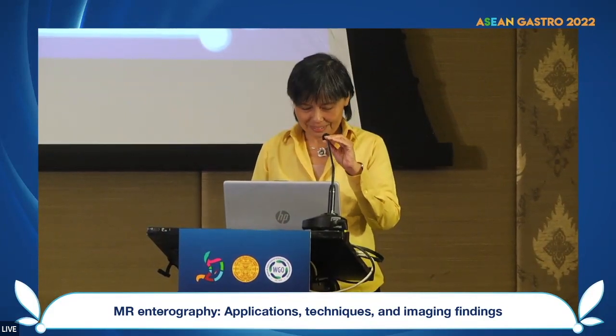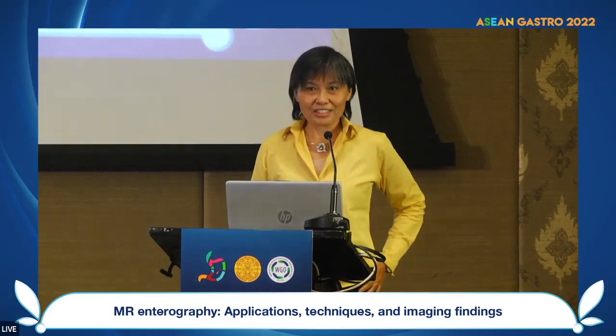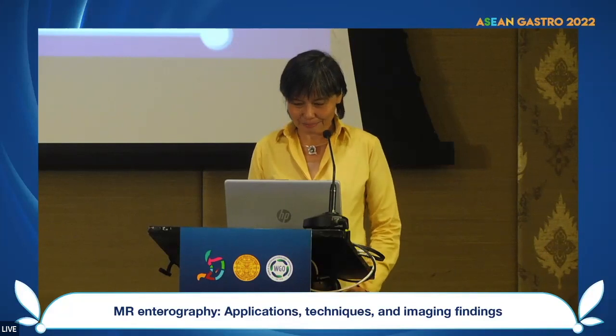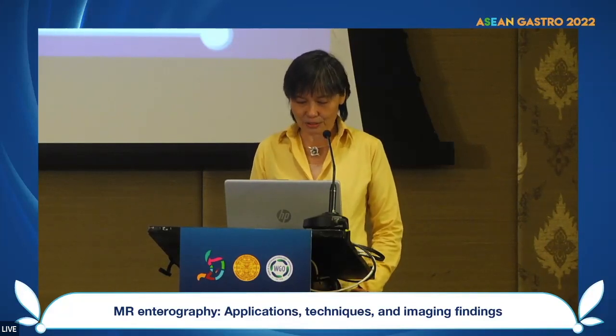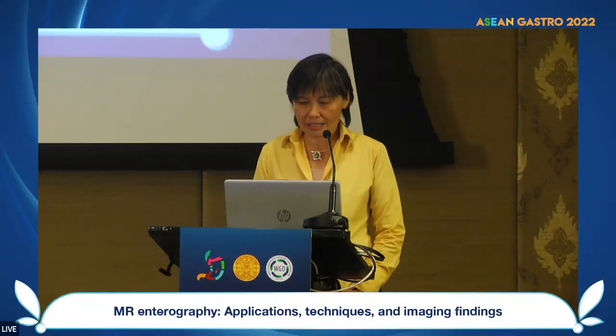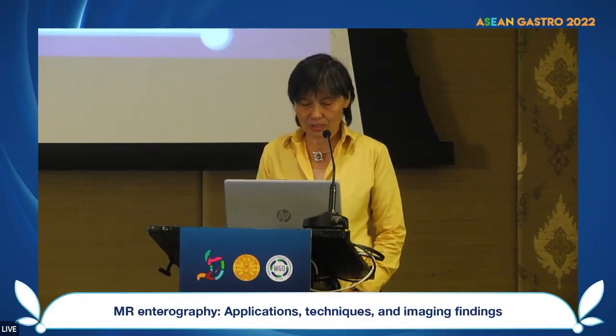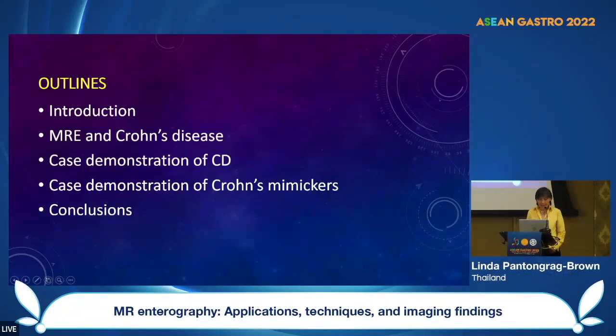Thank you. This is my first on-site lecture since COVID, so it's my great pleasure to be here and participating in ASEAN Gastro 2022. My topic today is MR enterography, and I want to focus only on Crohn's disease for today's discussion. Here is the outline of my talk. I will start with a brief introduction, and I will focus on MR enterography and Crohn's disease, and I will show you several cases of Crohn's disease and its mimickers, and then conclusions.